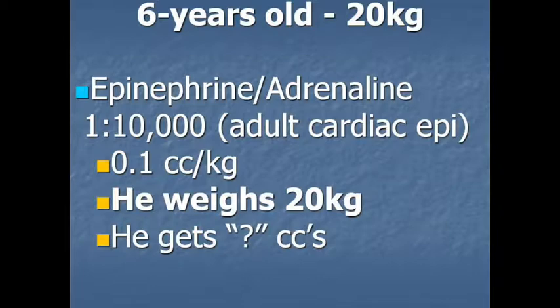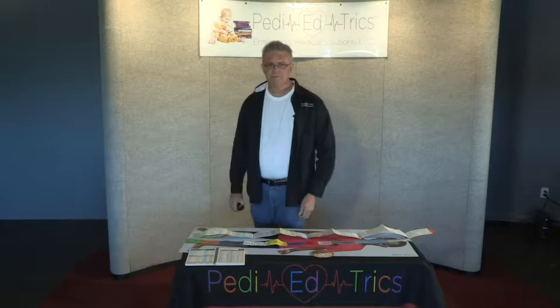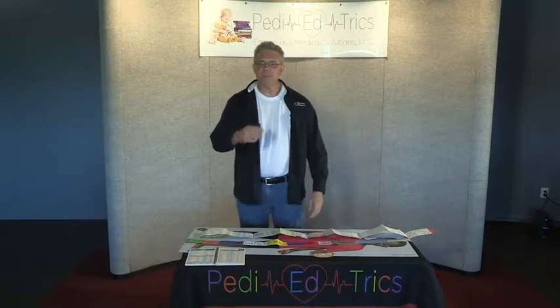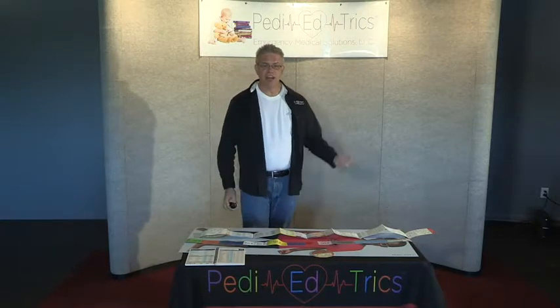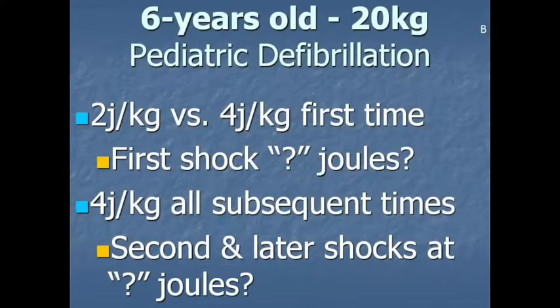So if you have to shock this kid, the easiest way I've ever come across to defibrillate a little kid is called pick up your paddles or pads and count them. Because if you pick up your paddles or pads, how many hopefully should there be? 2. And if there's anything but 2, put them down. A different professional should shock this kid. But if you can count, you can shock, because here in the United States, it's 2 joules per kilo the first time. And if that doesn't work, 2 times 2 hopefully continues to be 4. So it's 4 joules if you have to shock them after that.